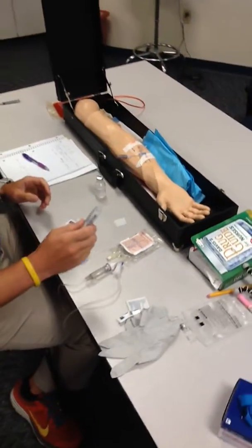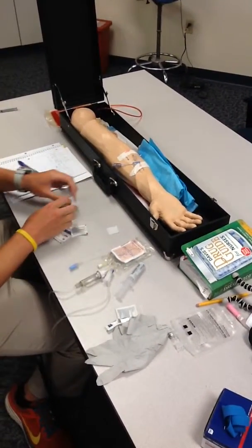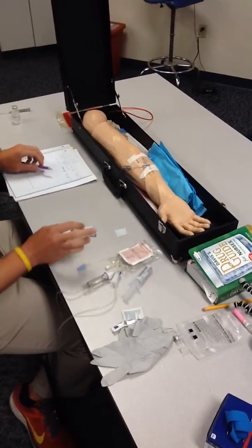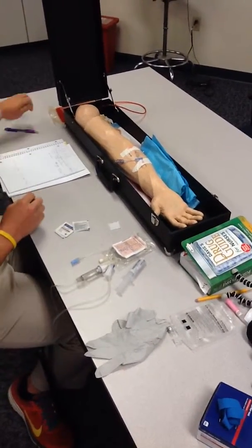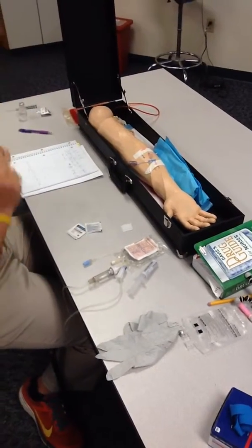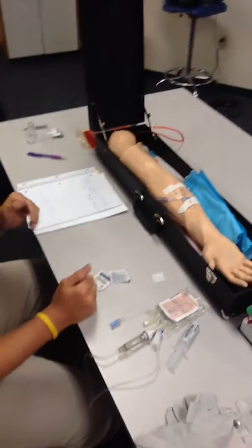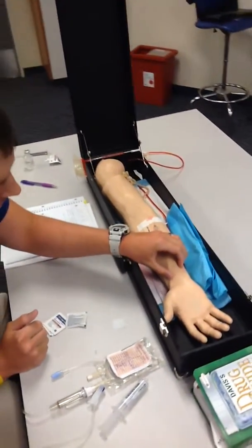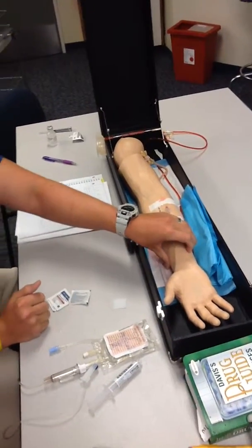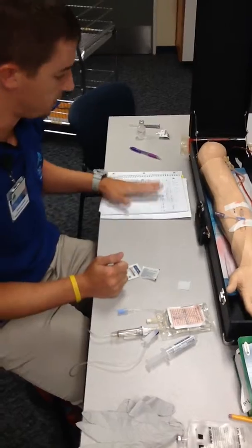I've grabbed myself a normal saline flush to take to the patient's room. We've taken everything away. All trash has been put away. I will go to the patient's room now. Hello, Mr. Jones. How are you doing today? Can I get your name and date real fast from you? Alright. Date and name are same as shown on the MAR.